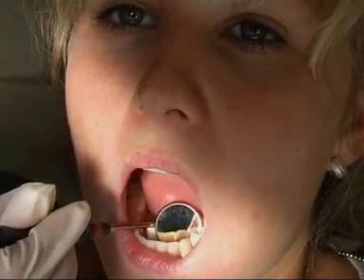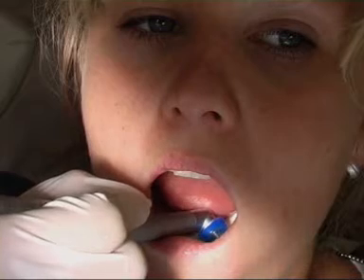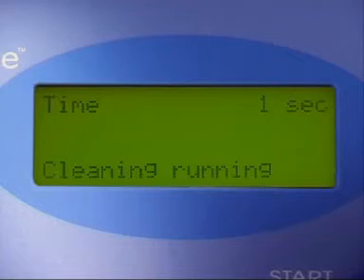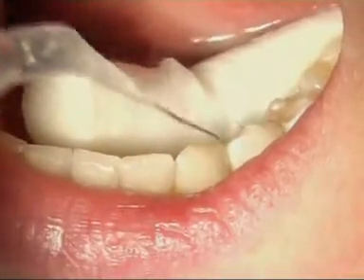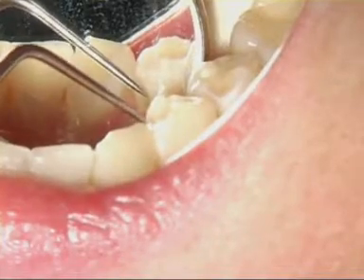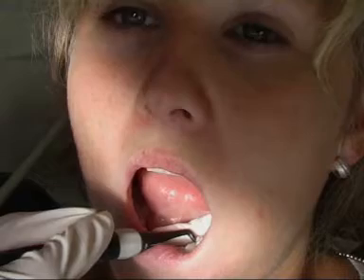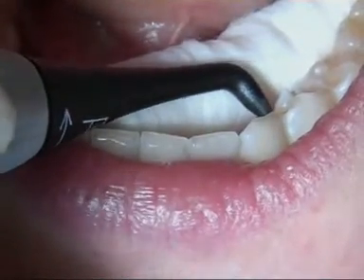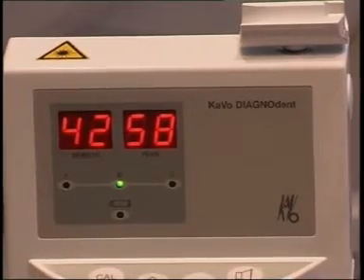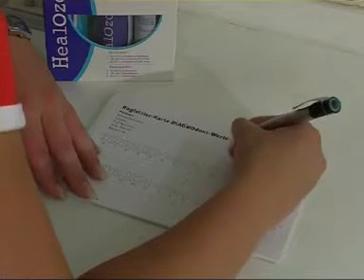Depending on the constitution, the patient can be invited back for a check-up, which will involve another Helosone application after only two weeks. The final session usually takes place between four to six weeks after the initial treatment. The caries lesion is probed to check its healing progress. Microbial activity is then analyzed using Kavo Diagnodon. The level measured is not for proving that the tooth has healed; rather it is used as a new reference value for the healed tooth. Please note this figure down carefully.